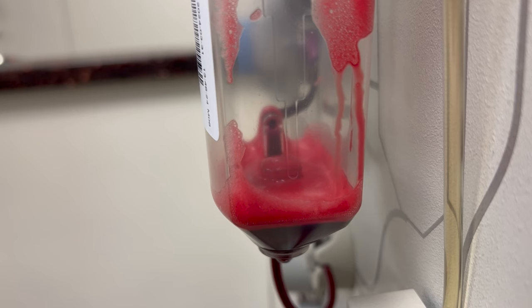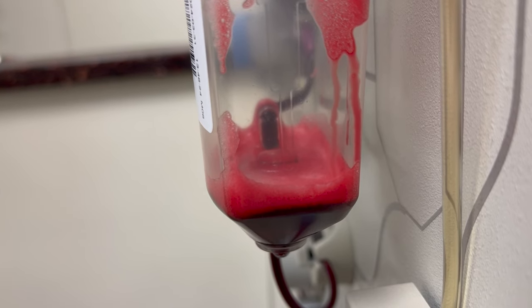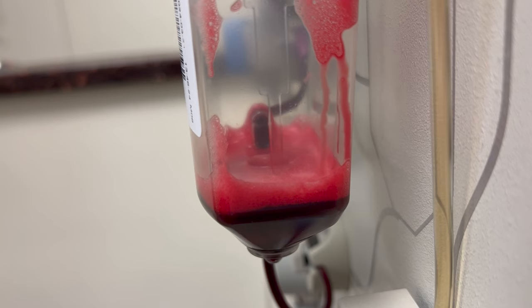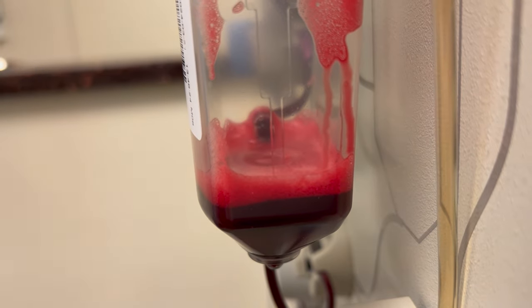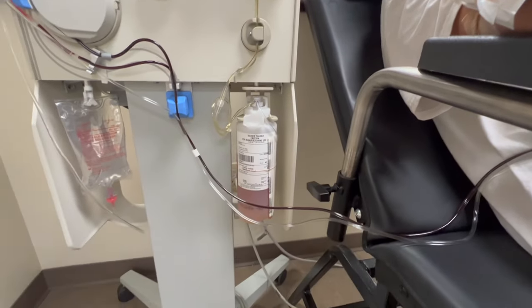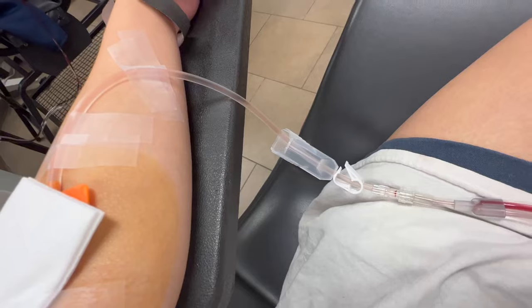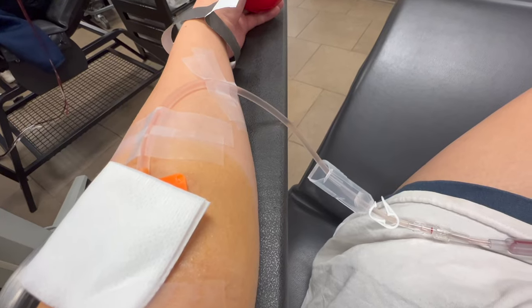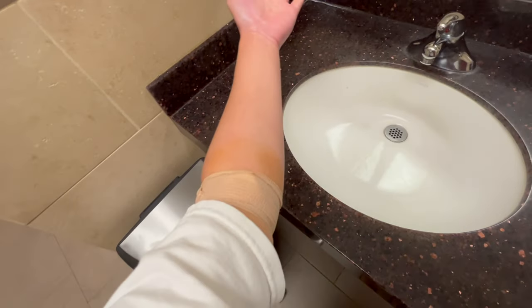Here's my blood being filled into the container — it's a really interesting shot, kind of disgusting-looking, but it has to fill up and drain down so your red blood cells can be returned to you. After all your red blood cells are returned and you've given all the plasma, a saline solution is injected into your arm to get your electrolytes up and return you to a regular hydrated level.